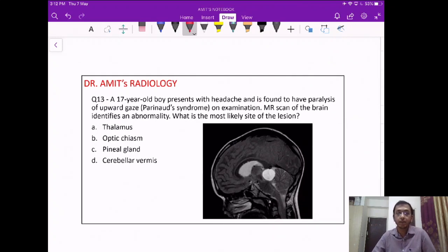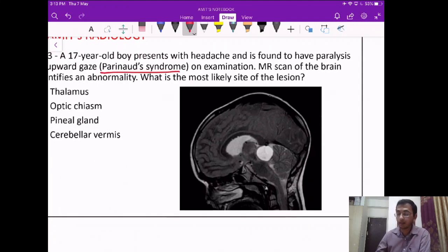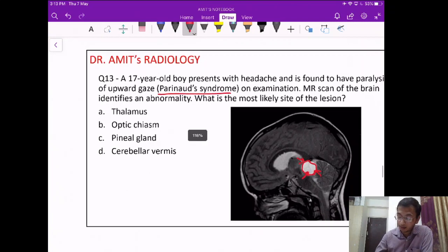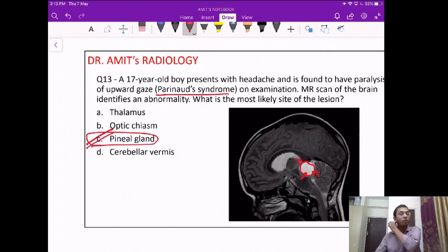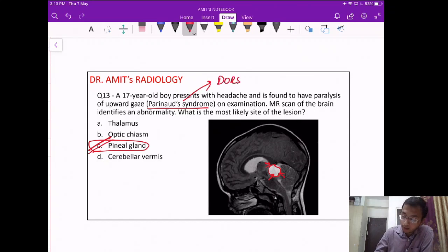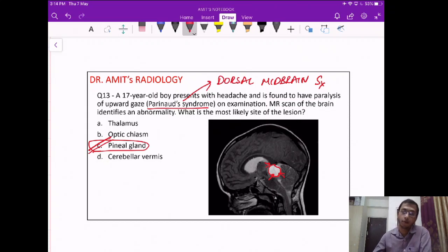Question 13: a 17-year-old boy presents with paralysis of upward gaze — Parinaud syndrome. Looking at the image, the lesion is present behind the third ventricle, behind the midbrain, just above the cerebellum. This location is characteristic for the pineal gland. Parinaud syndrome is characteristically seen in lesions of the pineal gland, also known as dorsal midbrain syndrome, since pineal masses compress the dorsum of the midbrain. The answer is the pineal gland.